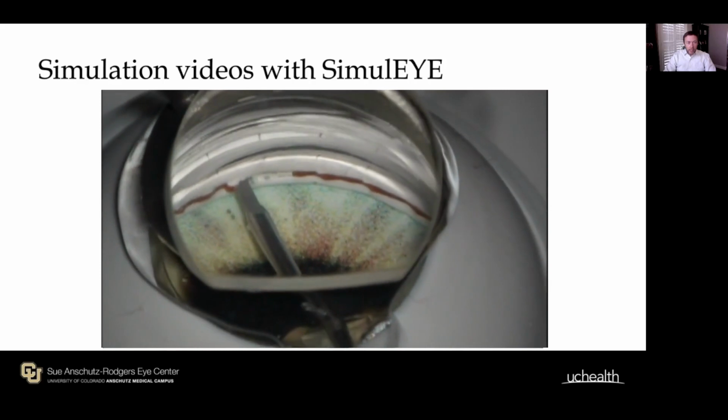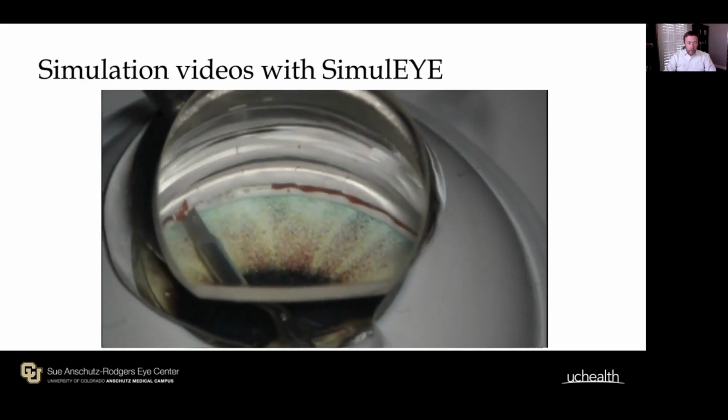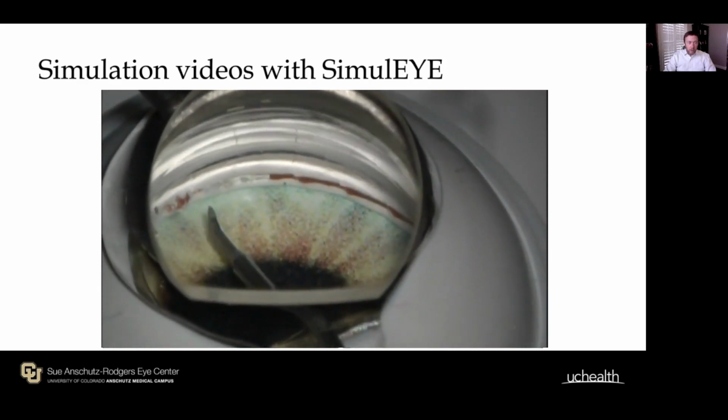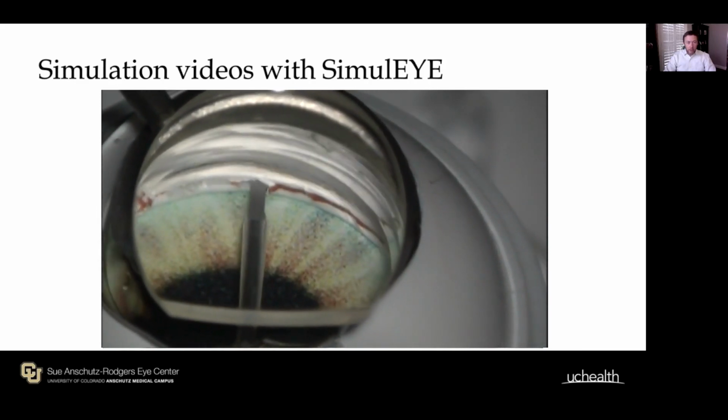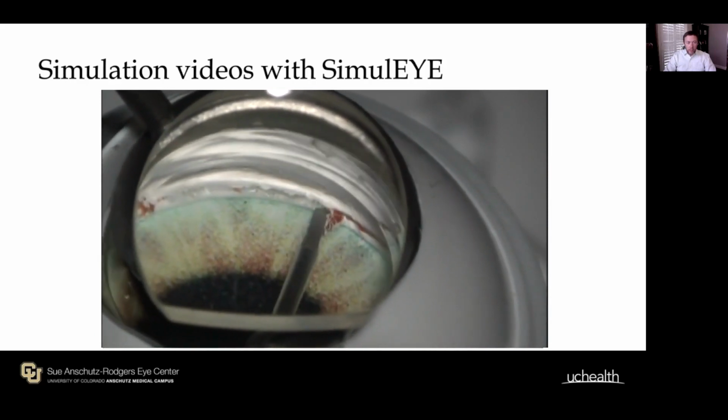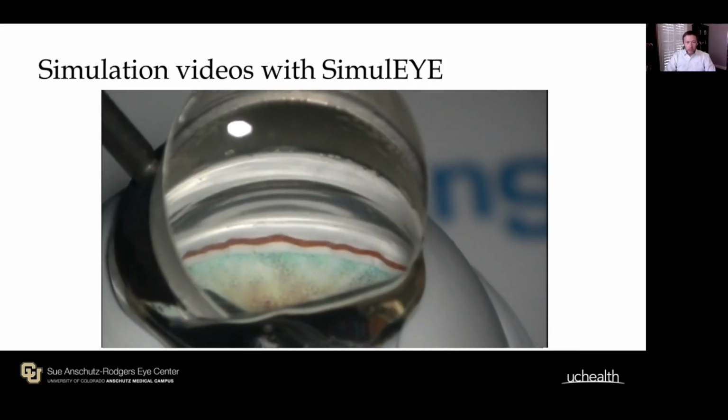Next is the inside-out technique. This is my preferred technique. We're starting opposite our wound, proceeding far to the left of our view, then reversing the blade. Now this is a backhand motion and going as far to the right as we can. This, I think, allows you to treat the greatest degrees of angle.